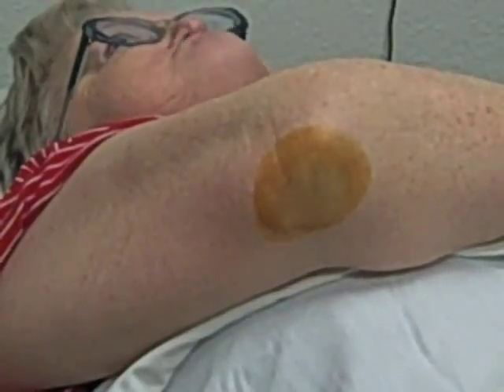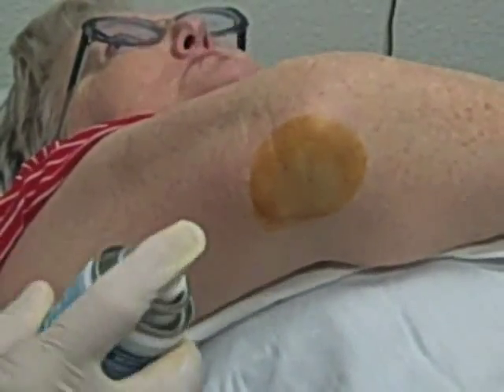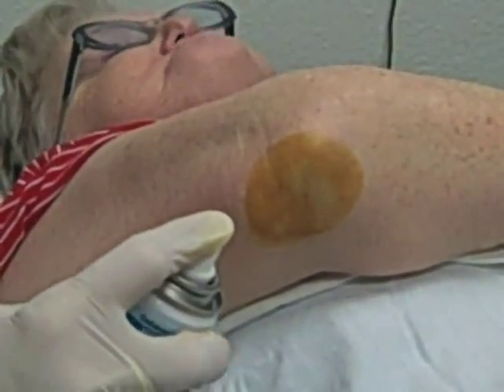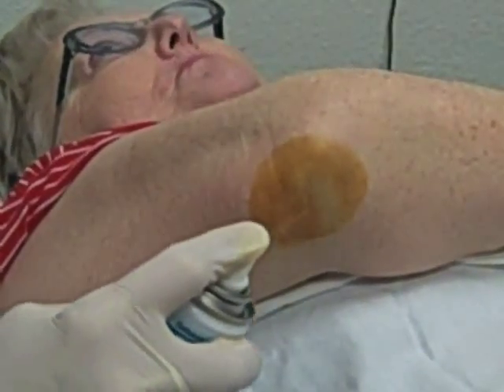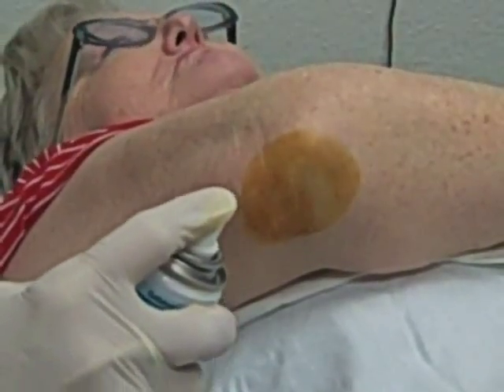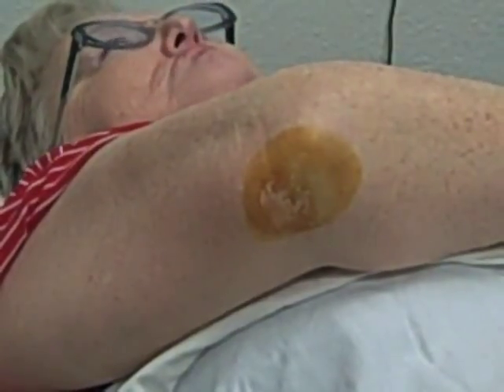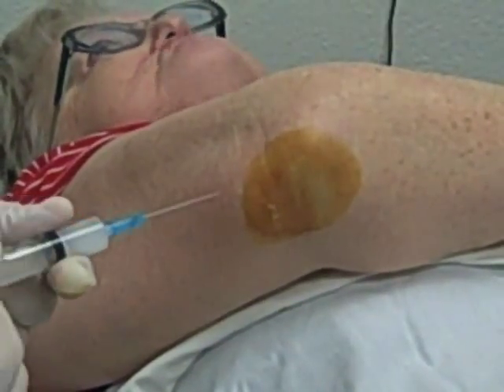With everything ready, we're going to use a local skin anesthetic — the ethyl chloride spray. We're going to spray for approximately two to three seconds, about six inches away from the skin. The skin is a little thinner than normal injection sites, so we don't spray as long as we would for a knee or shoulder injection. You can see the frost on the skin.